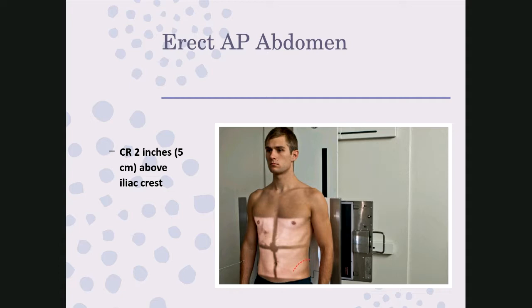If the patient came into your department and sat in the waiting room or was upright in a chair, seated on a stretcher, sitting, you always want to perform this exam, this picture, first before you lay the patient down, because when we sit, they have to be upright a minimum of 5 minutes.